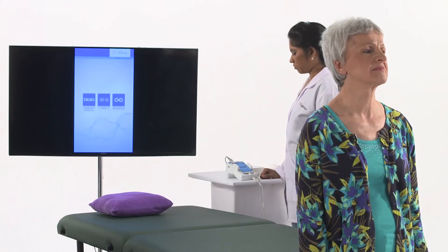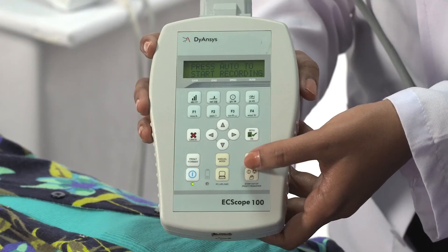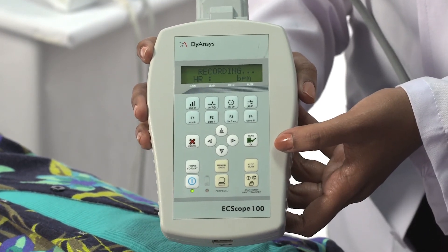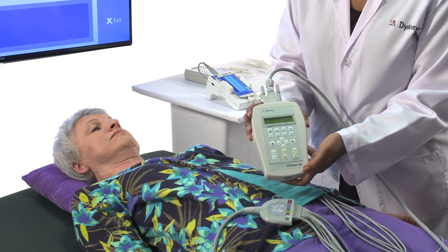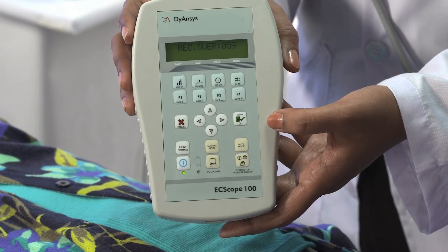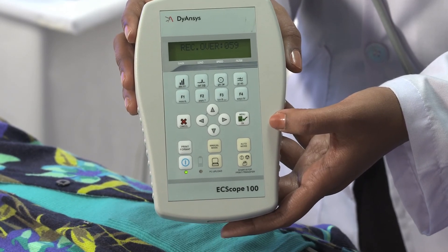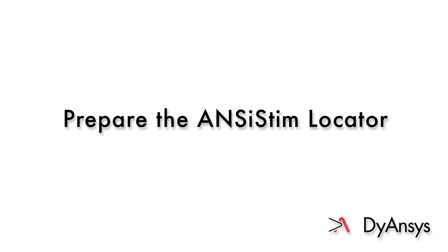Press Return twice to reach the Anciscope home screen. If dysfunction is greater than 35%, take a preventative interpretive ECG. If the patient has cardiac problems, consult with a cardiologist before beginning treatment.